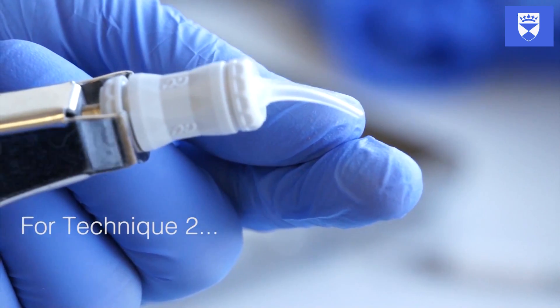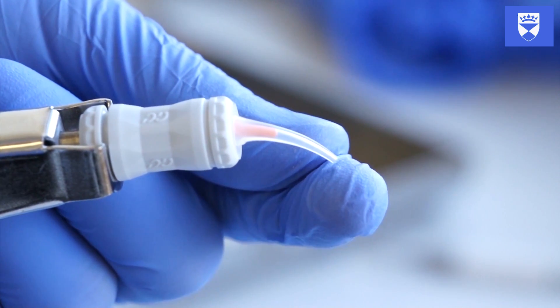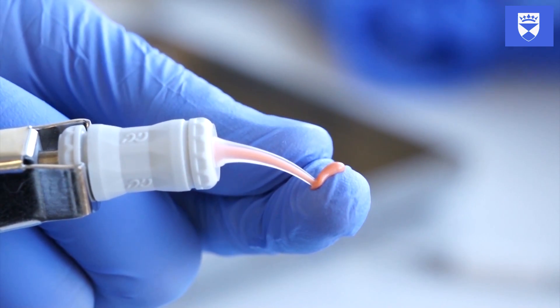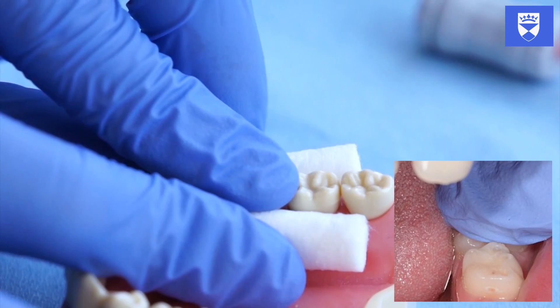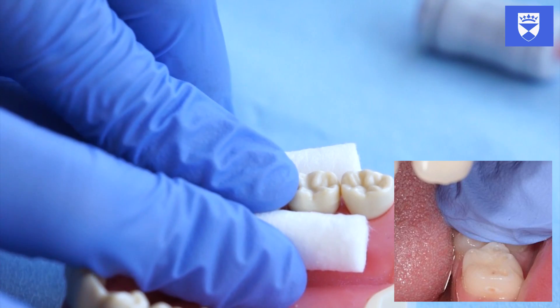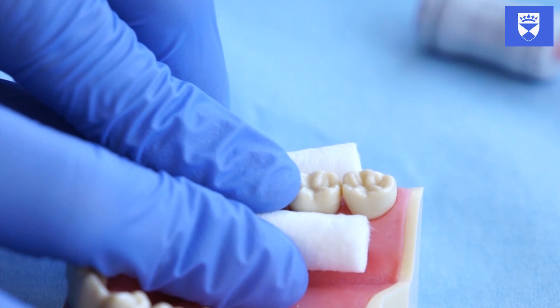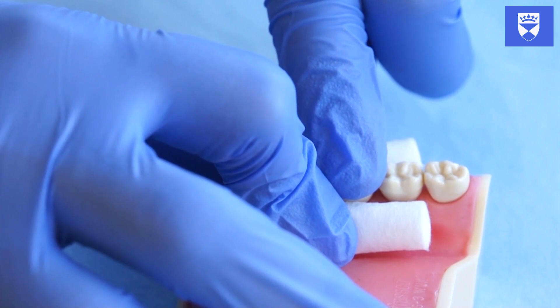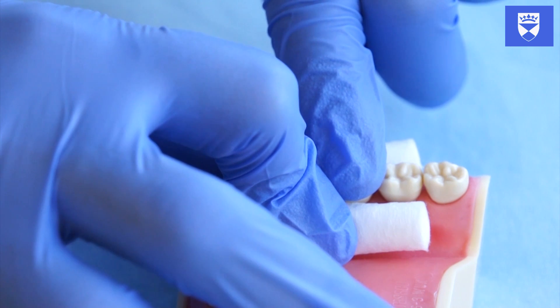Your nurse will place a small quantity of petroleum jelly on your middle finger. They will also place a small amount of glass ionomer on your forefinger, approximately the shape and size of a grain of rice. The actual quantity will depend on the size of the tooth to be sealed. Place your forefinger over the clean dry tooth and press the glass ionomer firmly onto the tooth. Keep the fingertip firmly placed over the occlusal surface and sealant for a full two minutes until the glass ionomer has set.